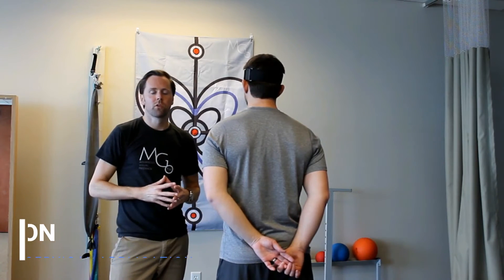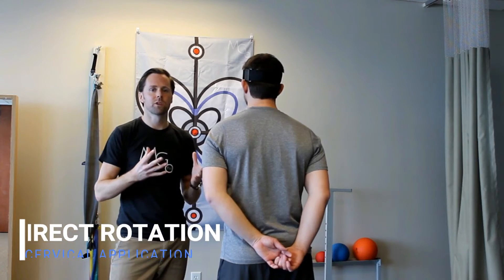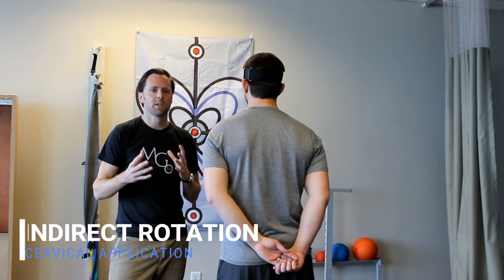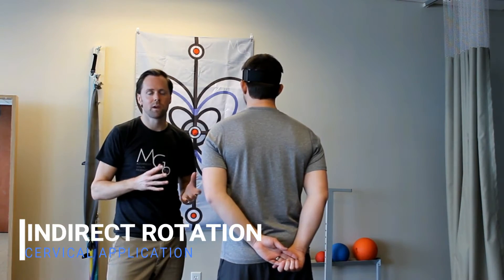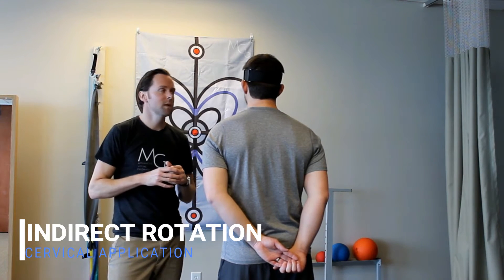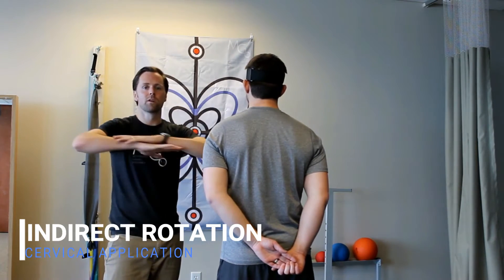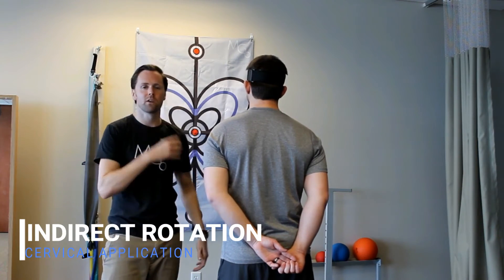Another way of looking at cervical rotation or range of motion — trying to obtain motion in a way that's different for the client or patient — is to get some indirect rotation going on. By keeping the laser centered in target while having them rotate their thorax, you can achieve that indirect rotation of the neck.